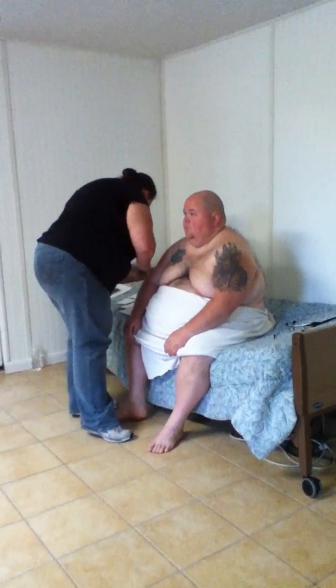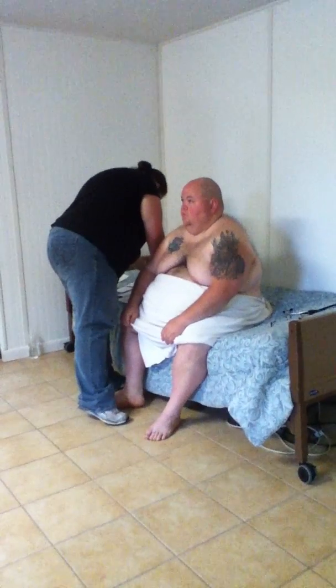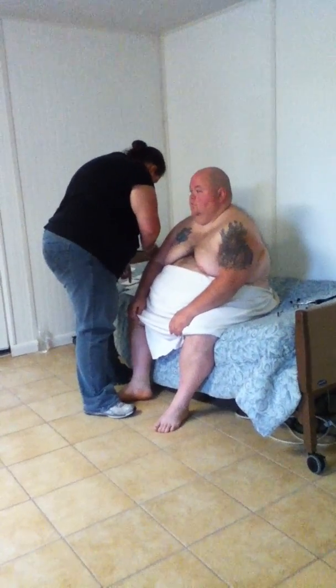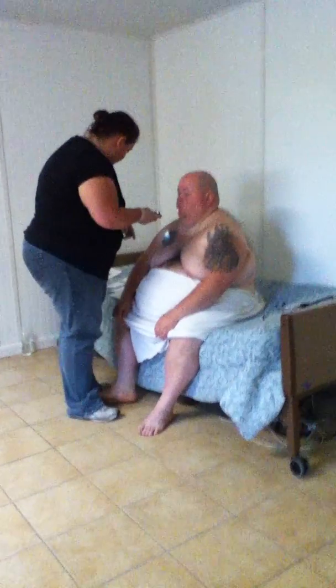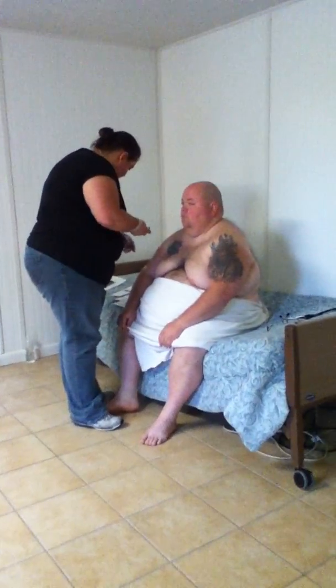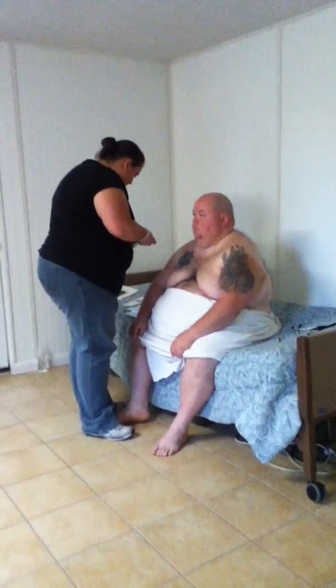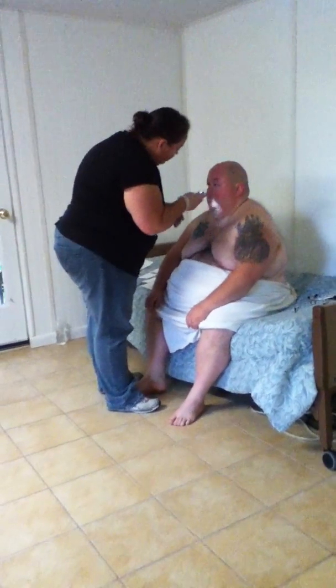Then you're going to get your ophthalmoscope, and you're going to start with it on 0 and start 30 centimeters away. Notice the size and shape of the pupils, the pupillary light reflexes, the accommodation.